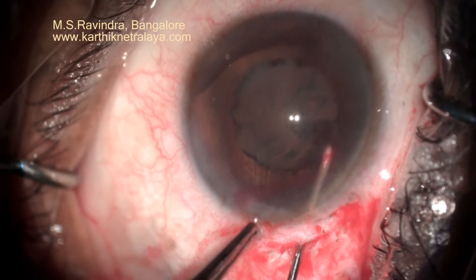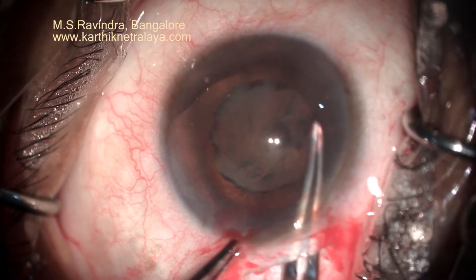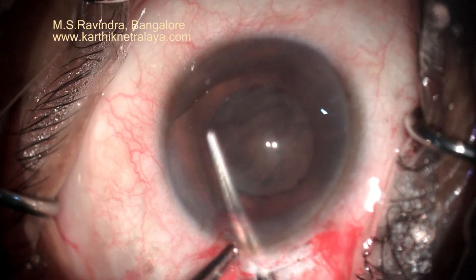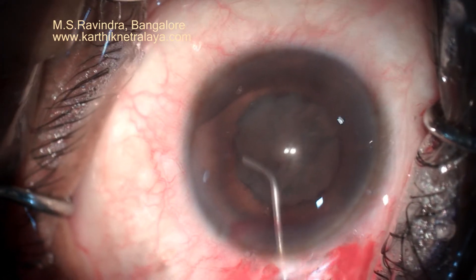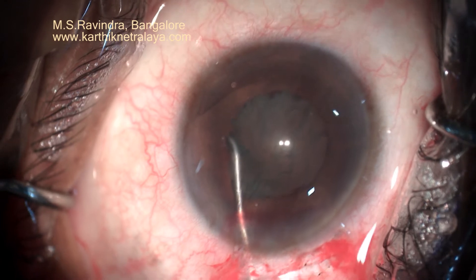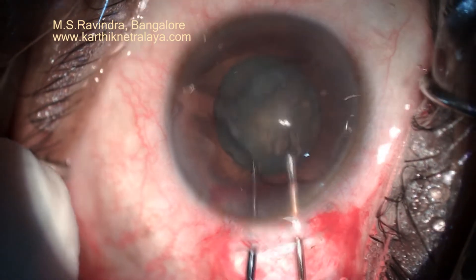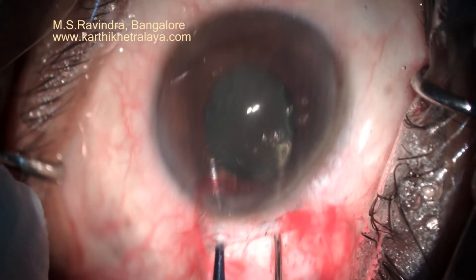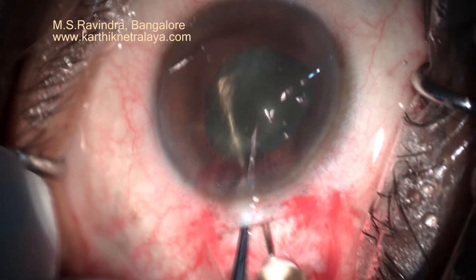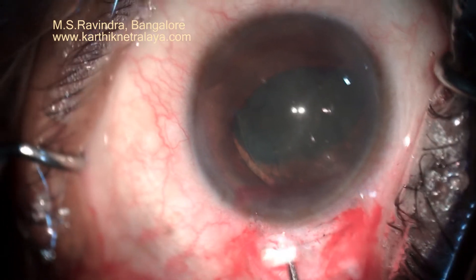It is still a circular pupil, which is more important in post-operative management. I have done a capsulorrhexis. Now I will do hydrodissection at one point using my special cannula. This hydrodissection cannula is extremely useful in directing the fluid at the equatorial area to initiate the cortical cleaving. The nucleus has prolapsed into the anterior chamber.